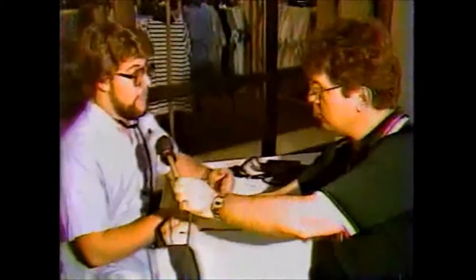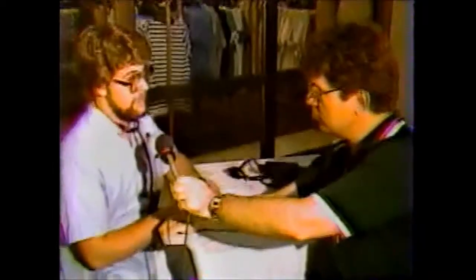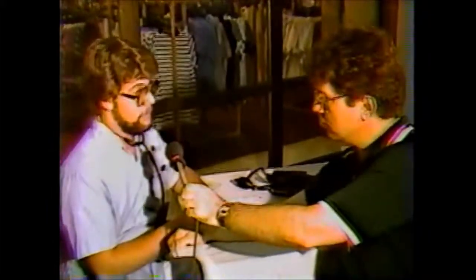Okay. Now, again, at what point are people suggested to check it out? In other words, when are we in a range where they should have their blood pressure checked out further? Okay. Yours here is 150/102. We're looking mainly at the norm person, the fictionalized person, John Q. Public, who walks down the street, should be about 120/80. But the systolic, which is the first number, goes a little bit higher. It fluctuates. The second number, however, should not go over 90. 90 is your borderline. We have a system here where we double check with some of the registered nurses from Winter Haven Hospital.